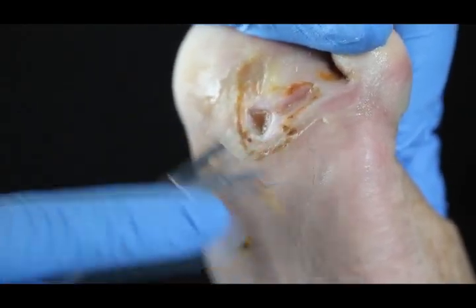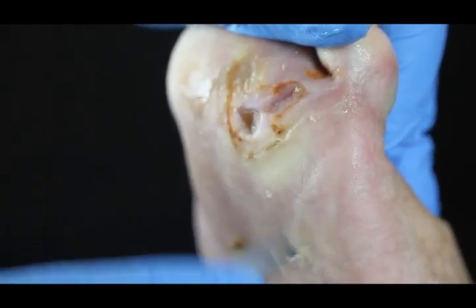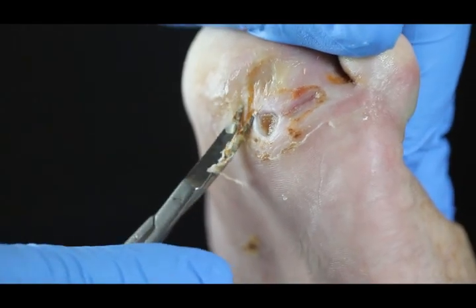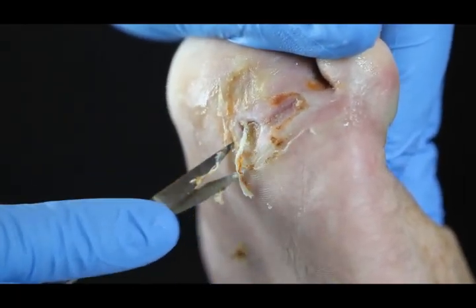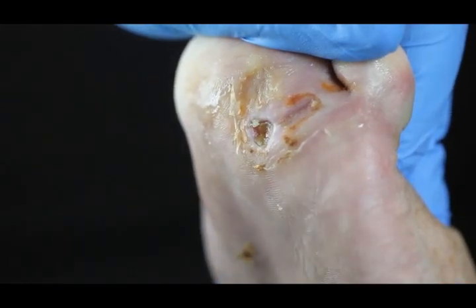The first thing in a diabetic foot ulcer is to get rid of the callus formation that develops around the wound. This callus formation may be from walking, but it can also be from inflammation from the wound itself. The cells in the peri-wound area don't know what causes the inflammation — they just know there's inflammation, and respond by putting out more keratin.